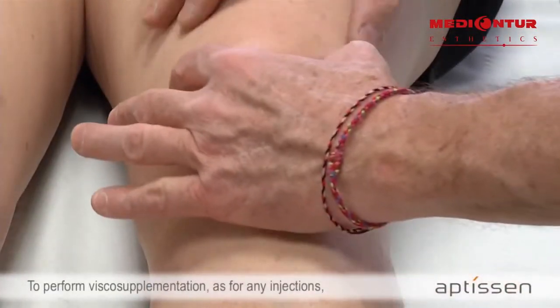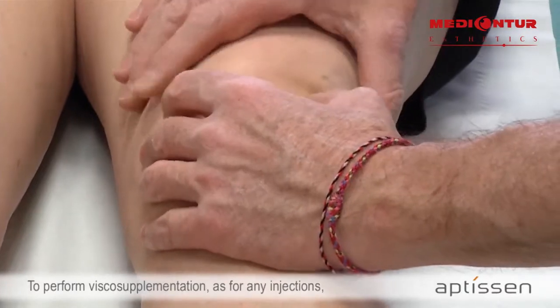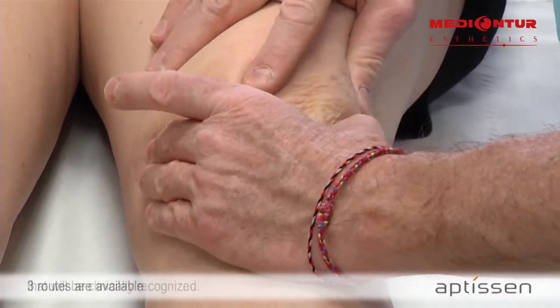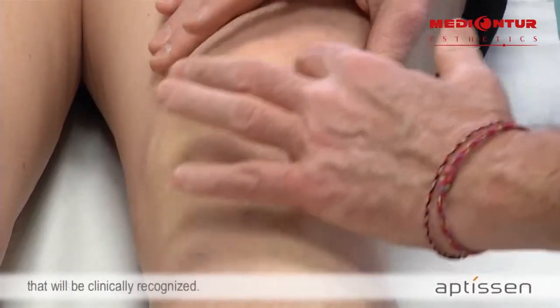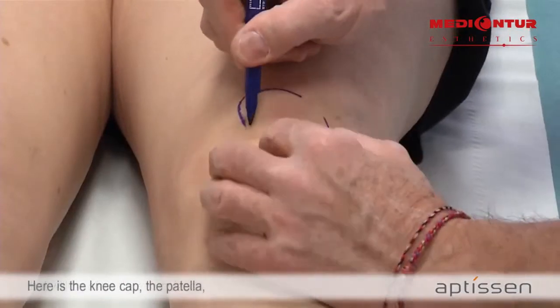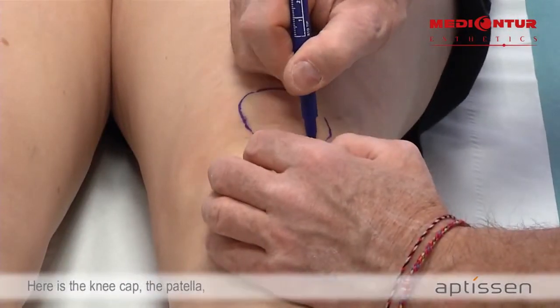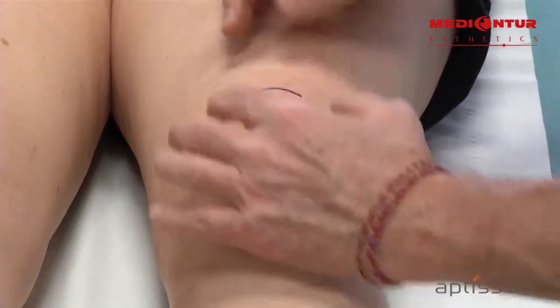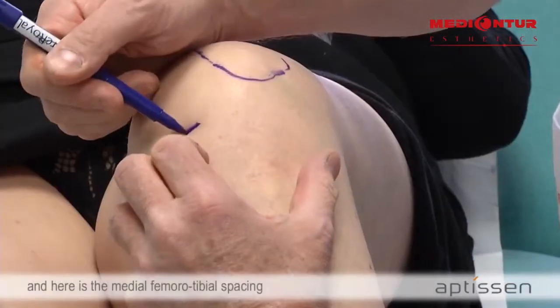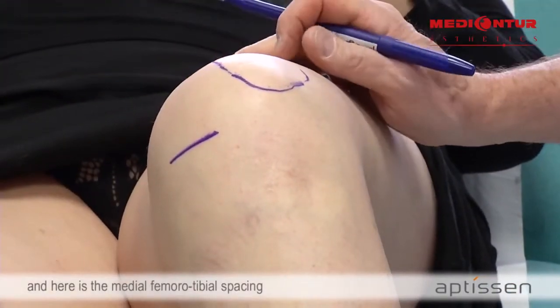To perform visco-supplementation, as for any injections, three routes are available that will be clinically recognized. Here is the kneecap, the patella, and here is the medial femoro-tibial spacing.